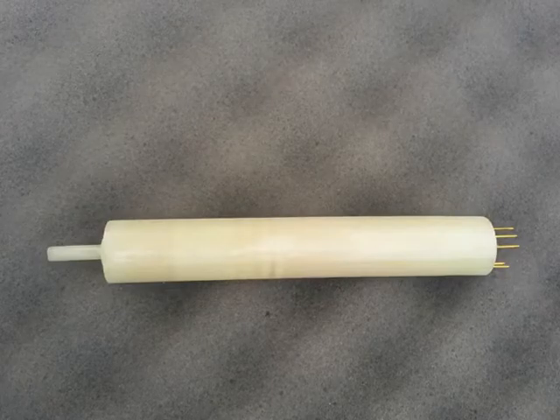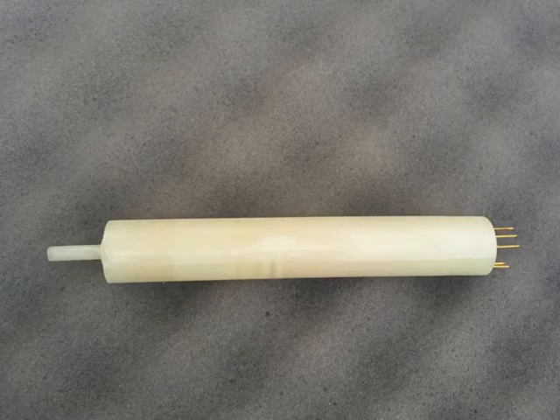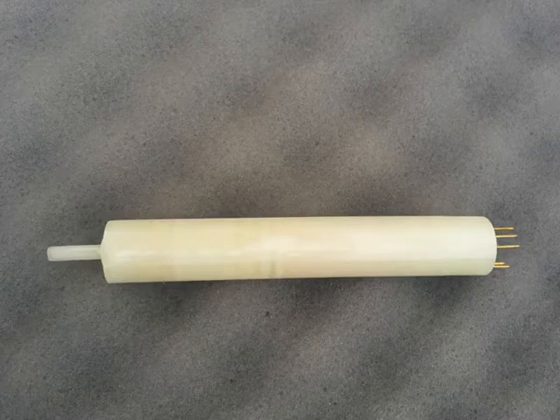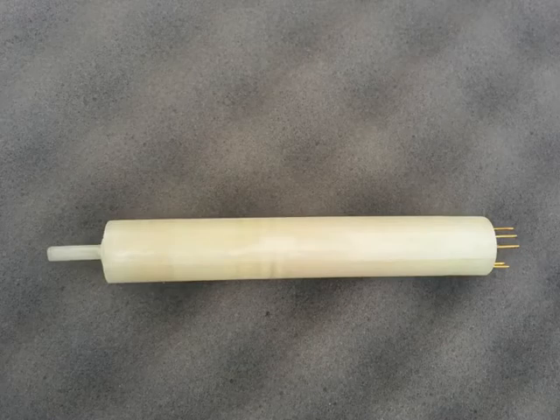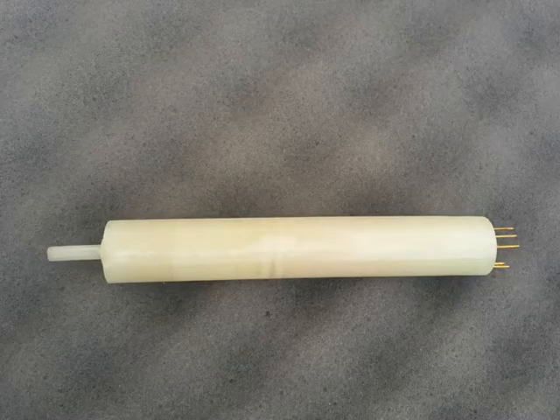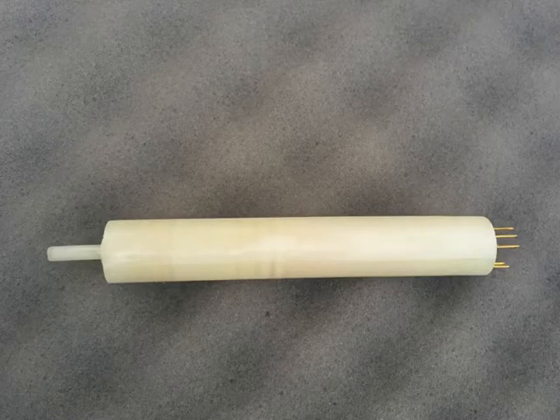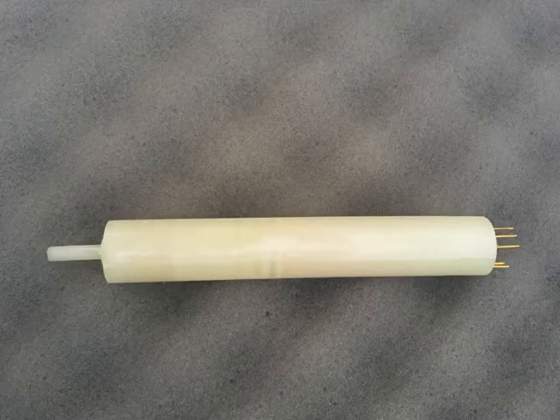Speaking of developing these components for surgical robotics, does Maxon use 3D printing for prototyping or actual production of components? We use 3D printing for prototyping, for proof of concept. In fact, I'm looking at a motor for Intuitive Surgical that was 3D printed on my desk right now. We do it to show, this is what we think the orientation of this connector coming off the side will be. We can build up dummy motors that obviously don't operate because they've been 3D printed, and that allows us to provide samples and proof of concept in a timely manner, in a matter of days as opposed to the weeks of lead time to get motors built.